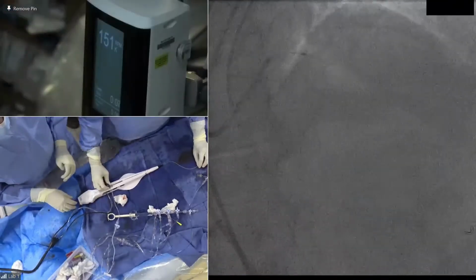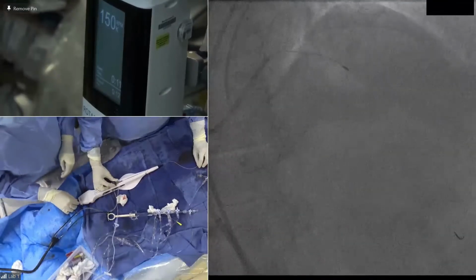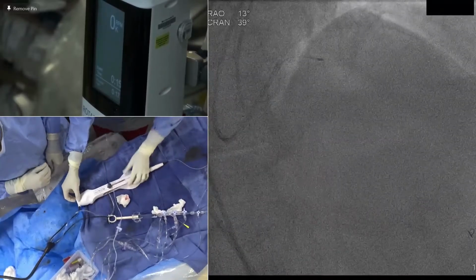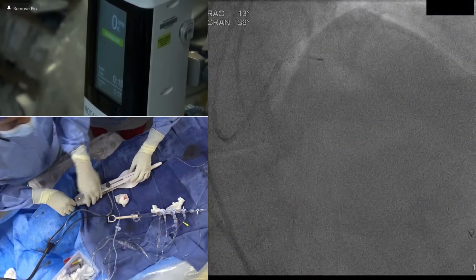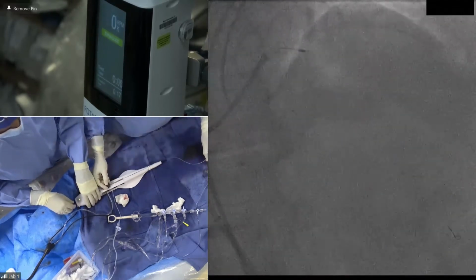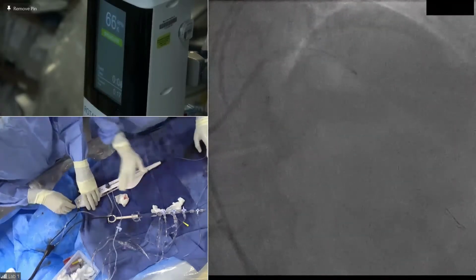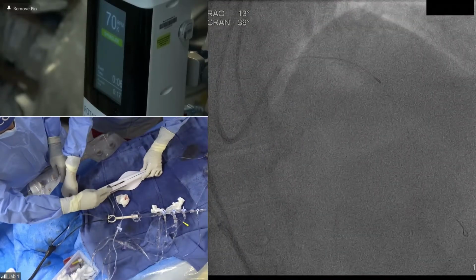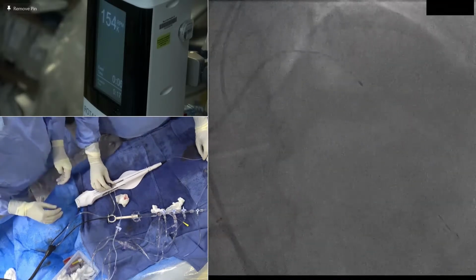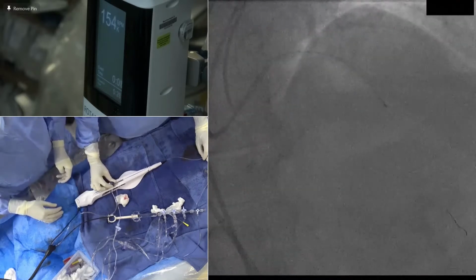Yeah, great. While we see the burr happening, can we talk a little bit about pharmacology during a rotablator case such as this one? Well, obviously, this patient had a previous PCI, so he's preloaded with a P2Y12 inhibitor. Dr. Sharma, which one do you use? Ticagrelor in this case? Yeah, so actually what happened is last time he presented 3-4 weeks ago with acute syndrome. He used to be on clopidogrel. I gave prasugrel last time because of acute syndrome. So he's on prasugrel and he's on bivalirudin.